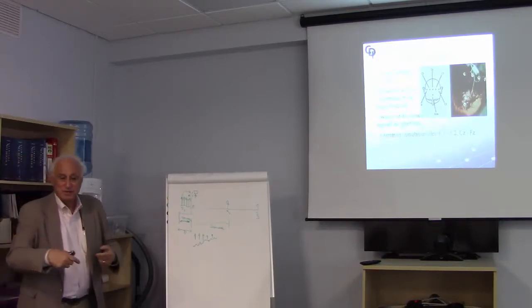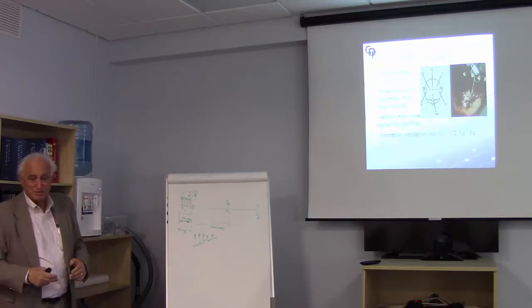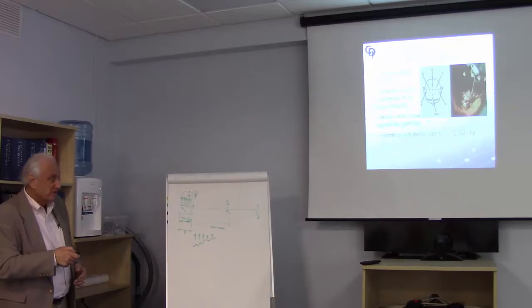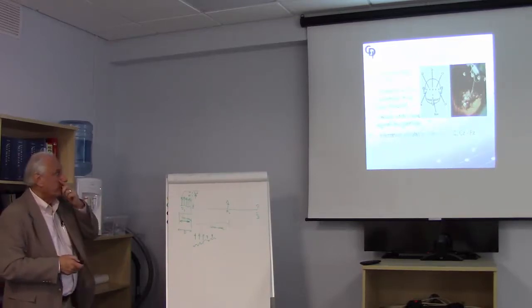So if you stimulate for your transcranial responses and you get a response on all the motor tracts at the same time, that's great, but it's also unusual. You can more likely expect to see the side of the anode being the most pertinent side.